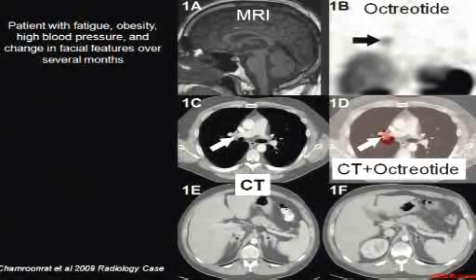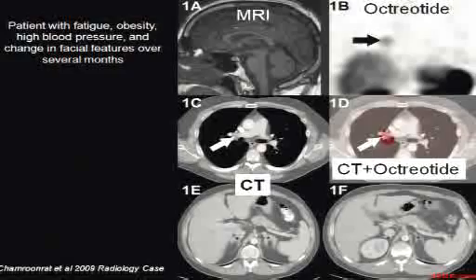This lesion is picking up this radiotracer called octreotide. This radiotracer is very specific for a secreting tumor, specifically for neuroendocrine tumor. And so now we know that this is likely at least one culprit for this person's symptoms. Okay? So in fact, this person ultimately ended up having a resection of this tiny nodule because there's, on this octreotide scan, no other metastases were found, and they thought that this person would be amenable to surgery.